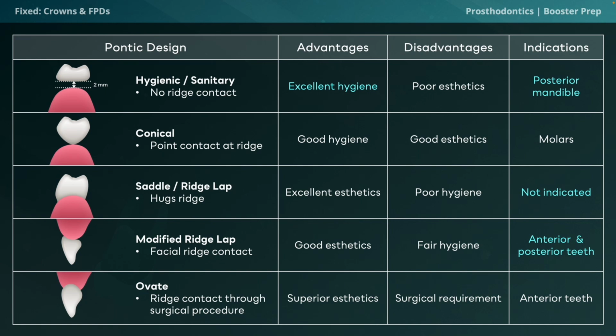This Pontic design is pretty versatile, to be honest. You can use it everywhere, especially for maxillary premolars where you need a fine balance between aesthetics and hygiene.